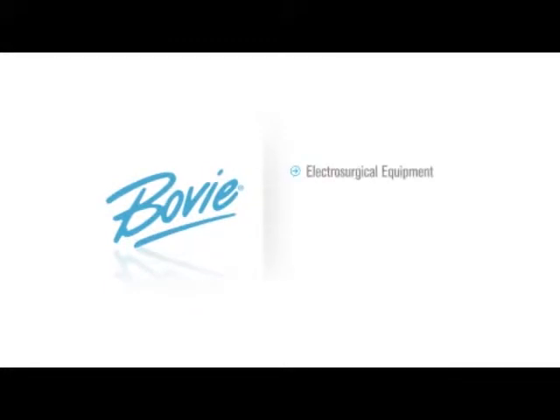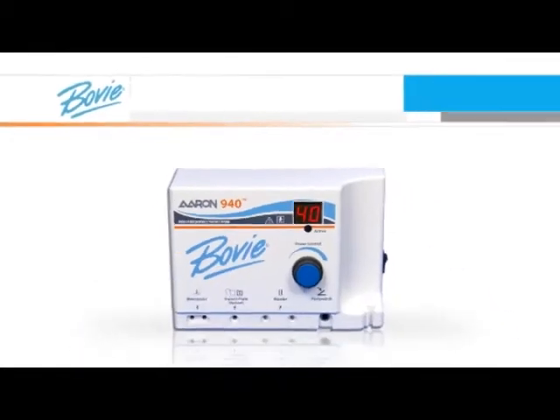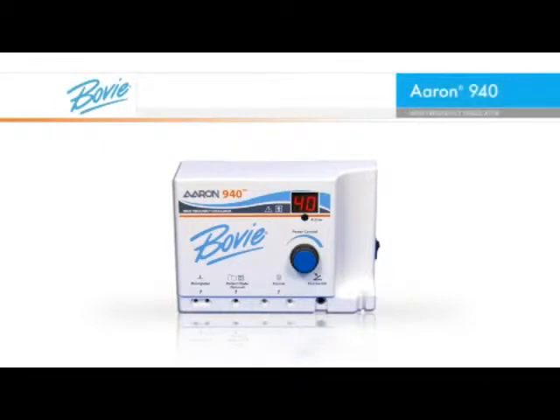Bovie Medical Corporation, a leading manufacturer of electrosurgical equipment, battery operated thermal cauteries and surgical lighting products, is proud to introduce the Aaron 940, a refinement to the office-based electrosurgical products used in desiccation, fulguration and coagulation.